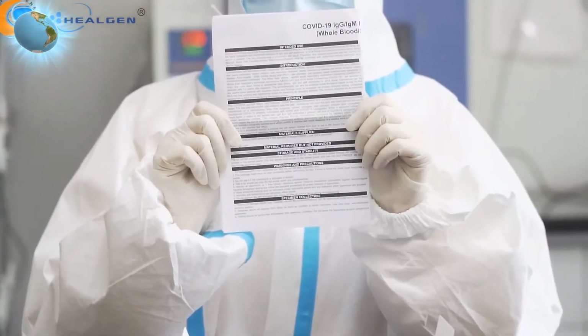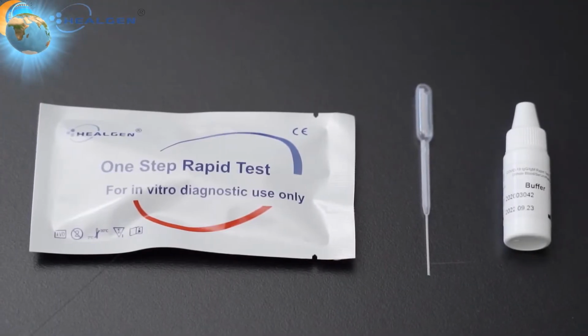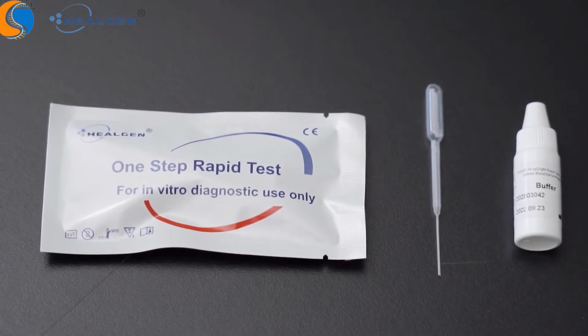Read the package insert carefully before use. The kit is composed of the test cassette, buffer, and dropper. Allow the test materials and specimen to reach room temperature before testing.